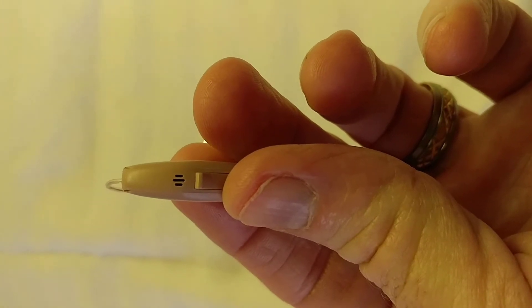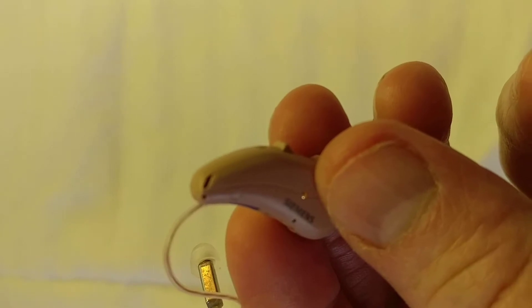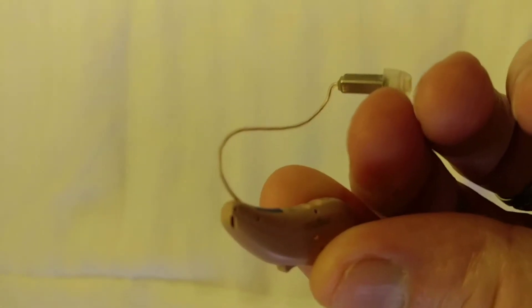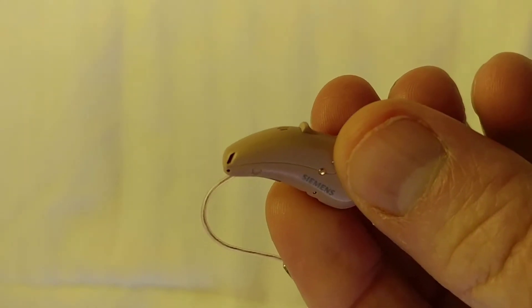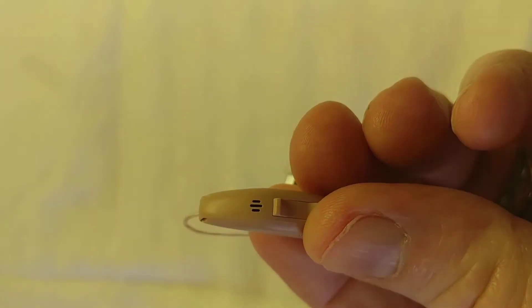When listening to music through a hearing aid, you're listening through mics. There's a mic on the back I just pointed out, then there's a directional mic on the top, on both sides, and this particular behind-the-ear hearing aid from Signia is called a Pro Max Pure.